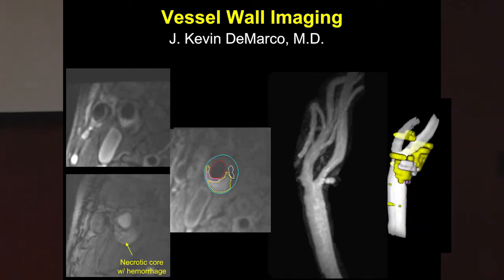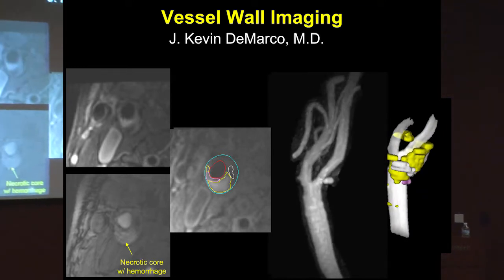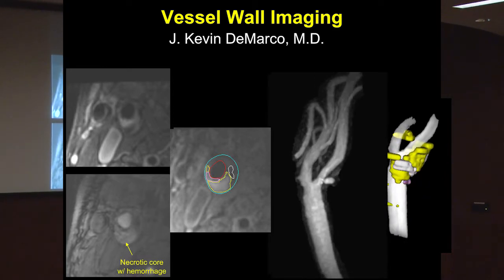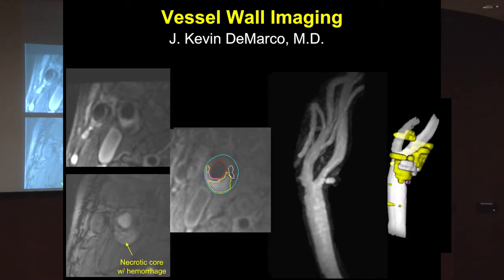What I always like doing with my presentations is to start off on the first slide telling you everything I want to impart to you, so if you want to fall asleep or check your email, you can go for it. And so what we've done before, and Jeff did an excellent job, is detailing how we get these very excellent quality images, typically with contrast enhancement, showing a moderate stenosis and ulceration.